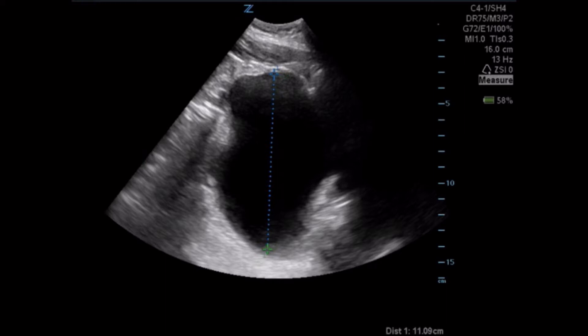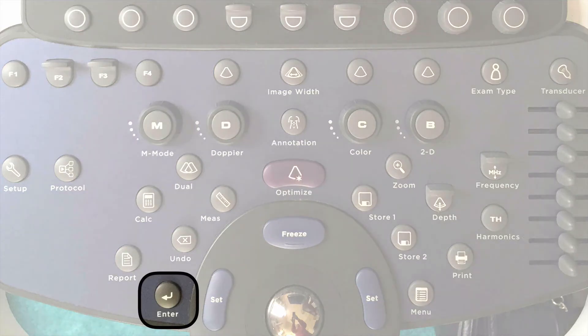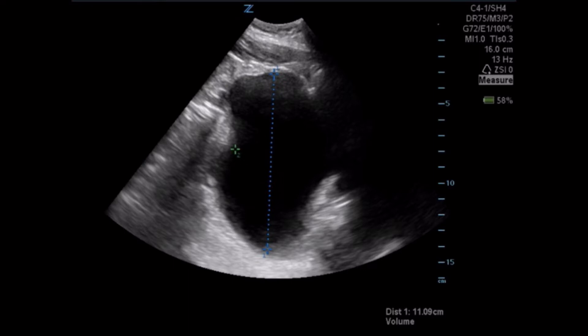Once you have that measurement with caliper set number one, you're going to press the enter key. This saves measurement one and gives you caliper set number two. Once you press the enter key, caliper set one is in blue and caliper set two is now green.